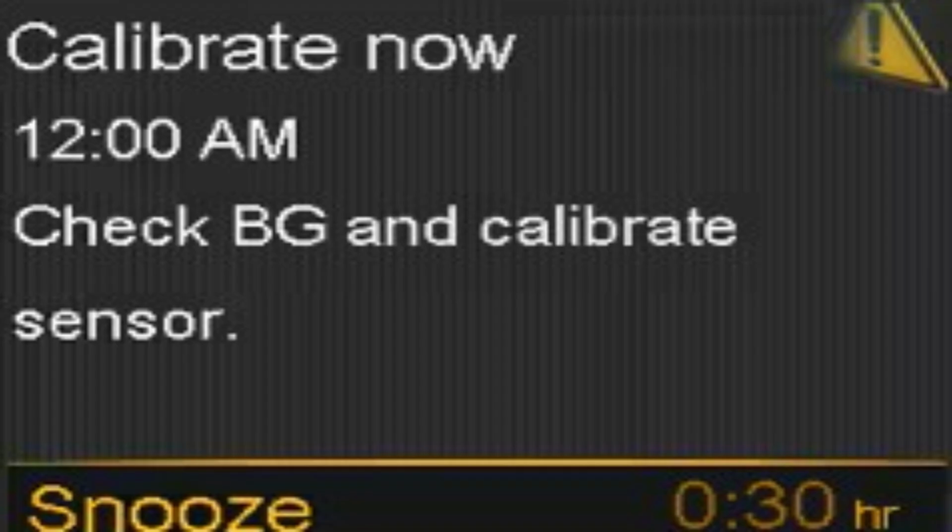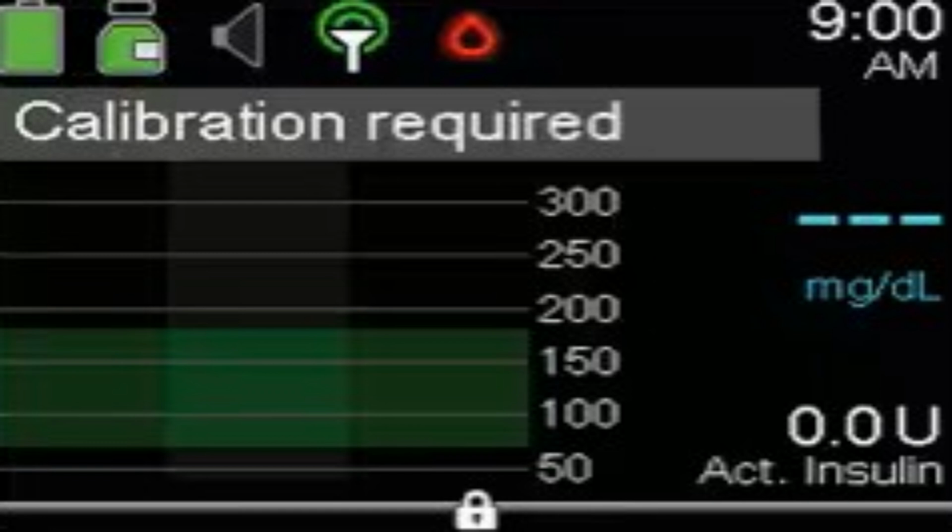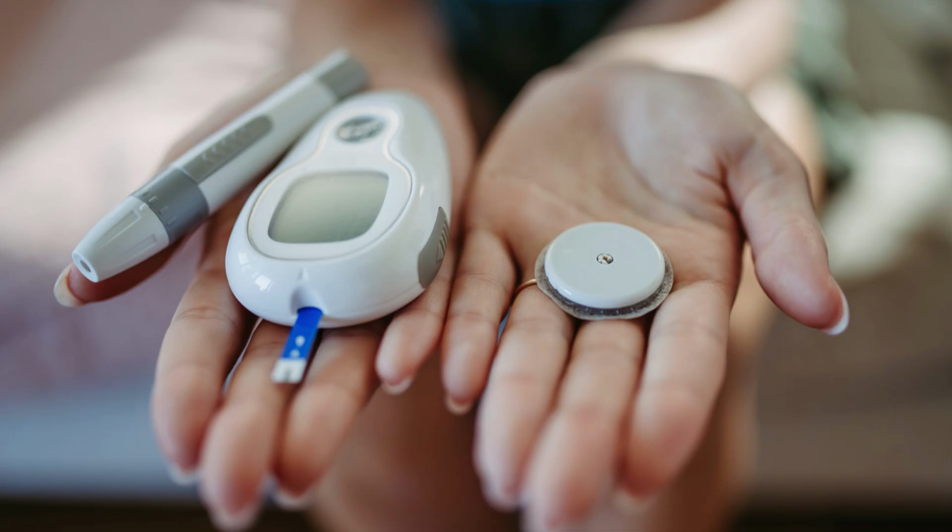The advantage of the flash over CGM is that you do not have to calibrate the sensor, while with some CGMs, you need to finger prick test twice a day or every 10 hours to calibrate the sensor.